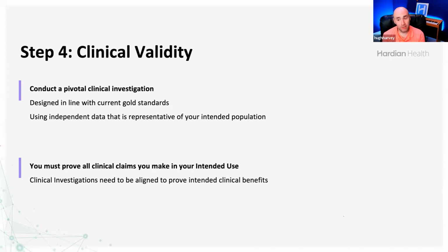I think the attraction of synthetic data is obviously around quantity and the ability to create data that is not linked to real patients. So you bypass any issues of cybersecurity and data protection. But in reality, the only true test of a medical device is going to be in the real world. So ultimately, you will need to use some form of real data. But certainly in the early feasibility phase, you can use synthetic data if you can show that that data is truly representative and has the same biases, substratifications, etc. within it that a real world data set might have.